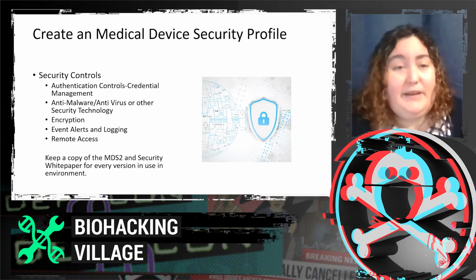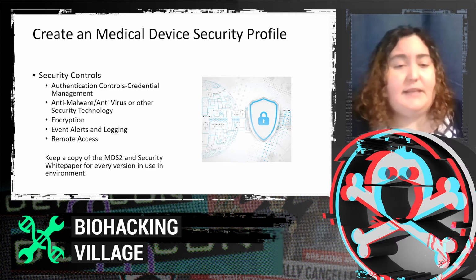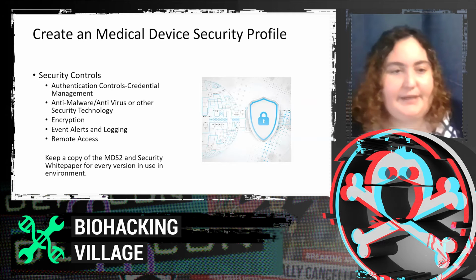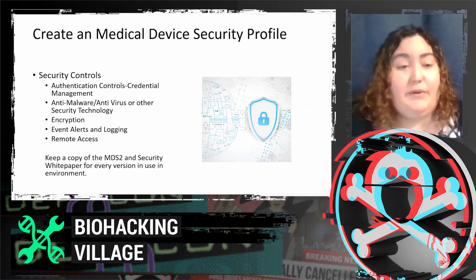So when you're creating your medical device security profile, you're going to want to take a look at the controls. What are the credential management options? Is there antivirus or other security technology available? Do they encrypt? You're going to ask what logging capabilities they have and how they manage remote access.